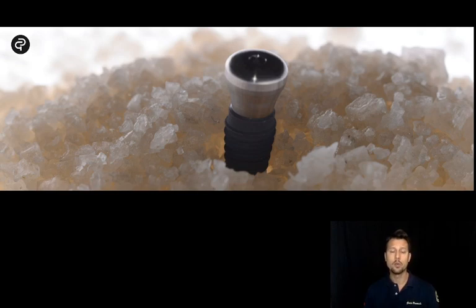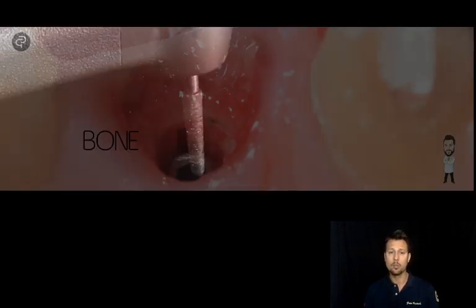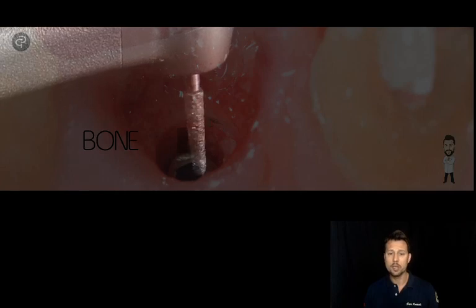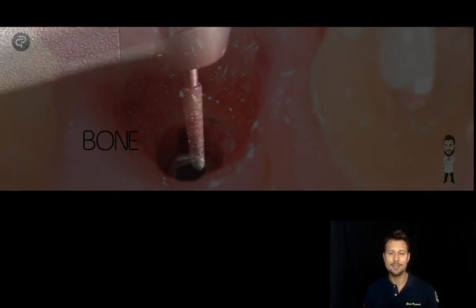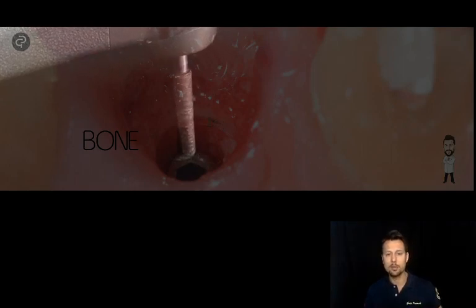Why? Because in this situation I usually perform immediately a small hole inside the bone on the microscope with a small bur, and I have no problem because here I don't have any connection that is a sealing connection. The sealing is inside, so even if I do some damage over this cap, there is no problem.